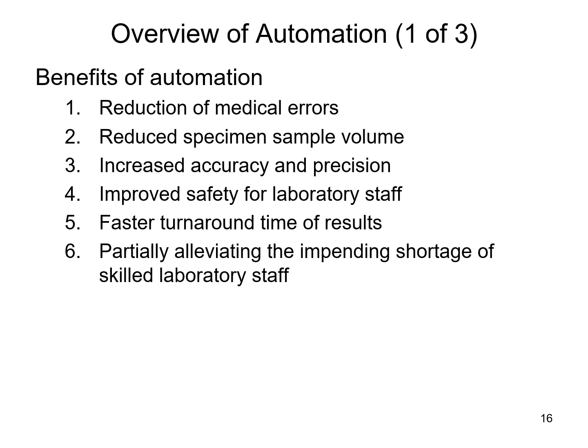Automation does help to reduce any sort of medical errors, especially when you have barcodes involved. It reduces the specimen sample volume, so by automation, we're able to use a less sample volume to run multiple tests. It increases accuracy and precision, and it improves patient safety for the laboratory staff, because there's less exposure to that sample with putting it on the analyzer. Then you're not being exposed to that sample as much by actually performing manual testing.